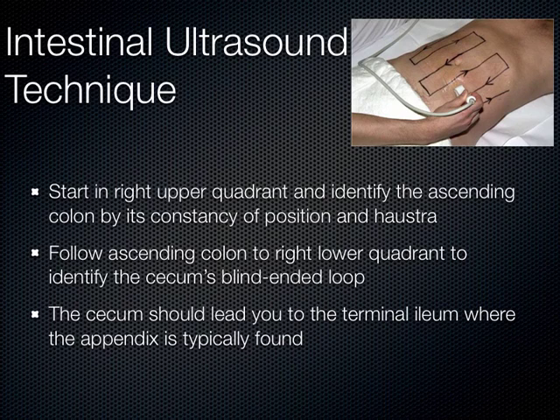They're just like little sections that are sectioned off, whereas in the small bowel, we have something called plicae circularis that do cross the entire wall of the bowel, which I'll show you in a minute. That's how we quickly can decide between small bowel and large bowel on any imaging study, looking at haustra versus plicae circularis. That sounds like minutia, but actually that comes into play quite a bit in most fields, so something you might want to remember.